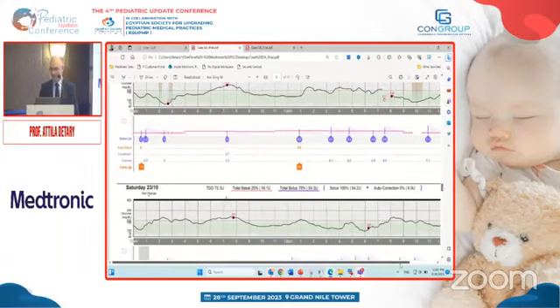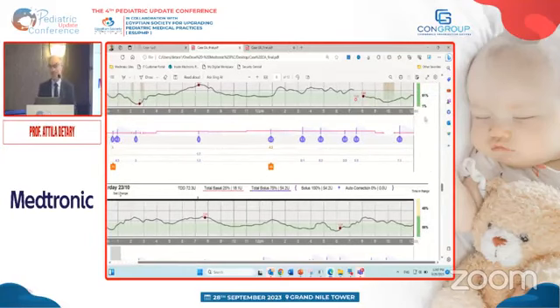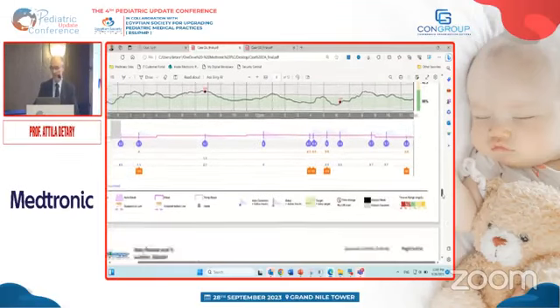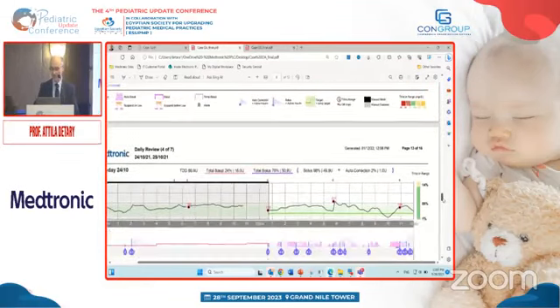And this patient already in the manual mode is achieving rather good control. You see, as soon as he started using the sensor, the control became better. Of course, he has to bolus, override the bolus. So it's a lot of action to do during the day. That's in the manual mode. And the payoff is around 50-60% in the range. So look at the day when the patient switched into auto mode.